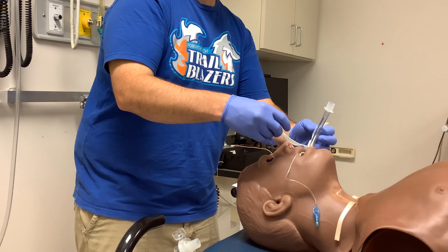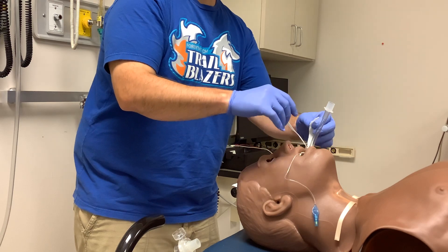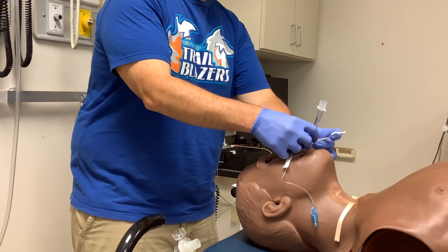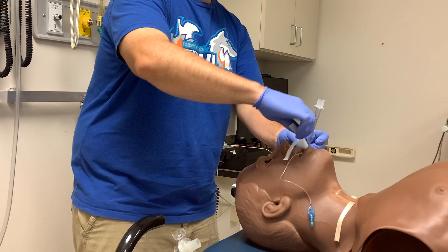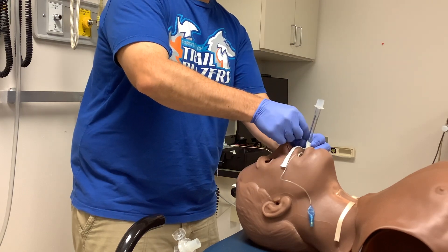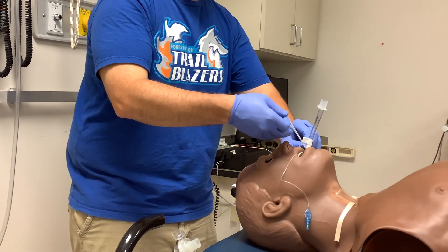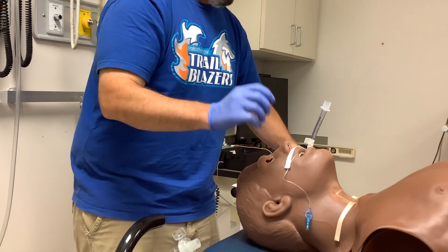A couple of different thoughts on this: you can take and wrap the bottom part around and place it here, or you can put the top on it. What I'm going to do is place this across the top of the lip. And again, that tape doesn't stick to this mannequin at all. But then I'm going to take the V so that I'm snug to the tape and begin to wrap around that endotracheal tube. You can kind of spiral up a little bit, but do keep in mind you're going to need to be able to see where the tube is. On a real patient, this top piece is going to stick to that top lip very well.